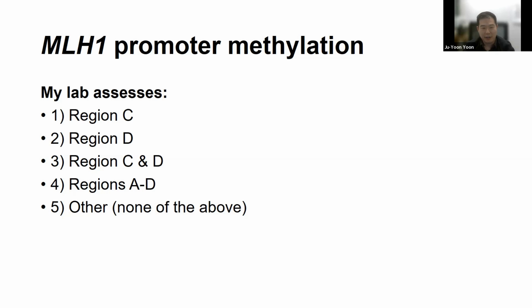If you're using MLPA, you're probably gonna be looking at regions A to D.